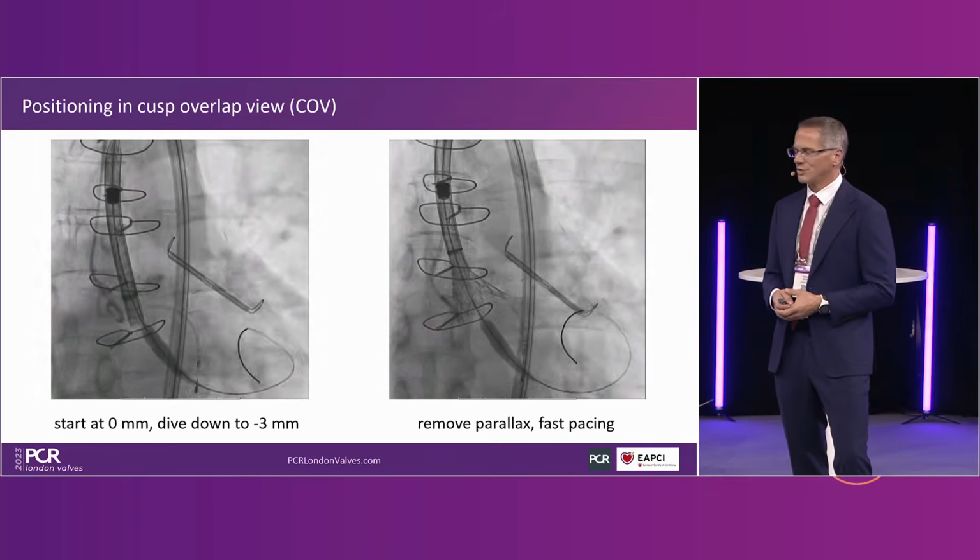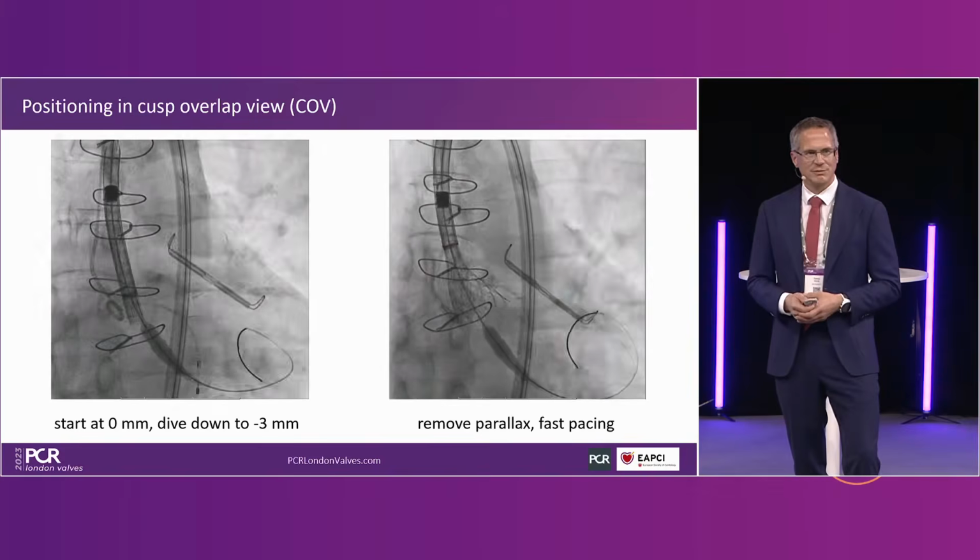Any question at this point of the implantation strategy? The markers look great there. I mean, they already tell you that you've got two of them overlapped. So it looks like you've got commissural alignment even before you complete.